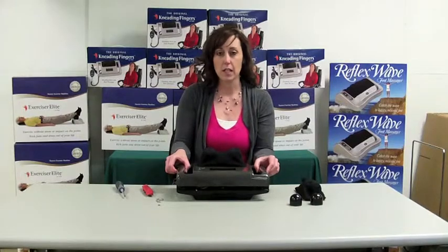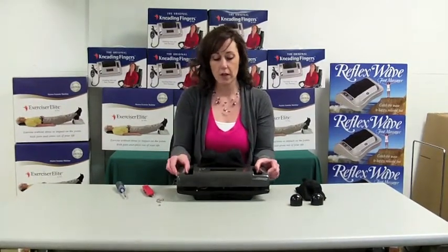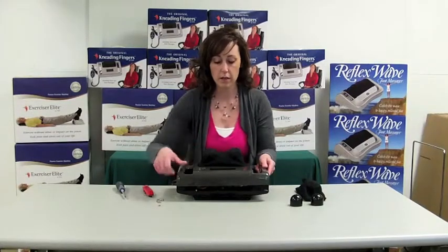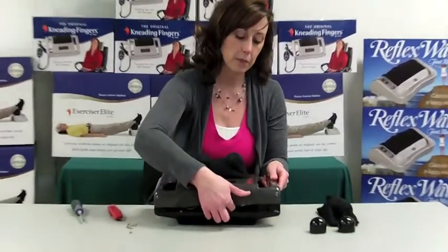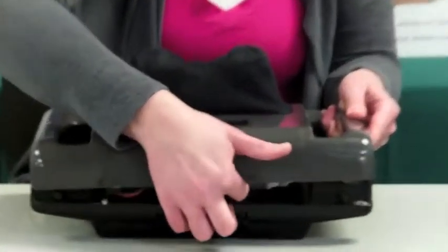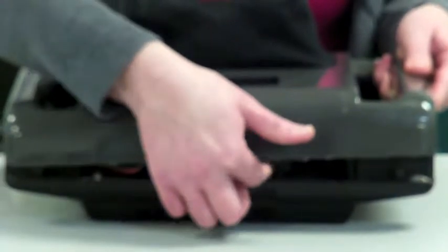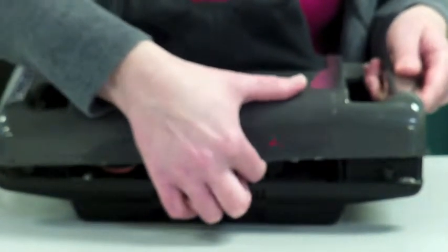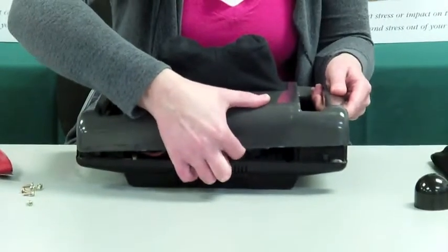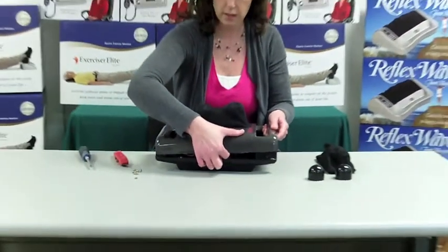On this machine, it's getting caught a little bit on the massage knobs. In that case, what you'll do is just take your finger inside the machine and you'll feel a round plastic wheel — that is actually the fan on the machine. As you turn that, it will move the massage knobs to where you can get the case lifted off.